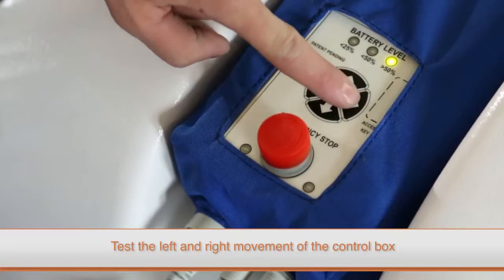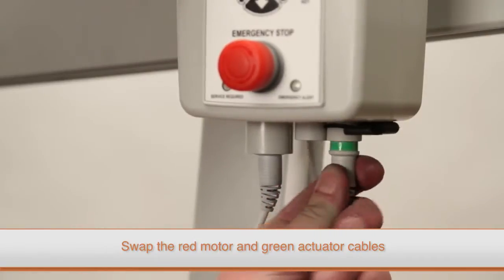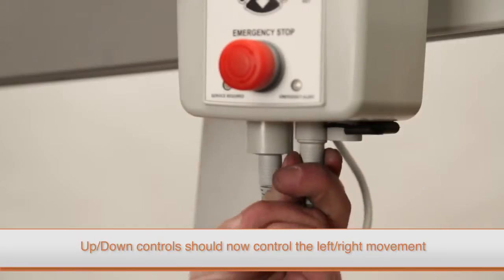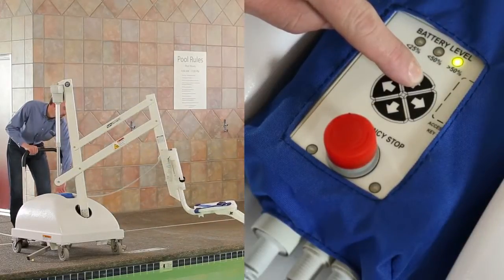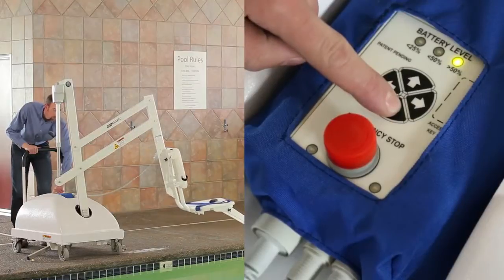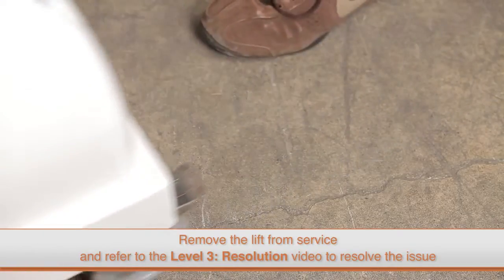When testing the control box, you'll want to specifically check the buttons that control the left and right movement. To do this, switch the red motor cable and the green actuator cable. By doing this, the up and down buttons on your control box should now control the left and right movement of the lift. After switching the cables, if the lift moves left and right by pressing the up and down buttons, you know that the left and right buttons on the control box are not functioning properly.